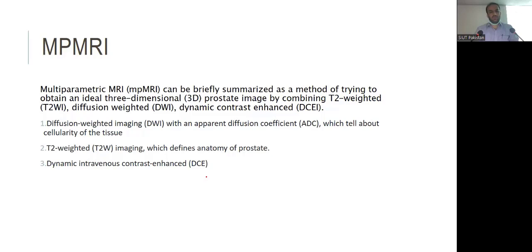On this basic rule we apply it to prostatic cancer and easily pick up the lesion, even small lesions less than 1.5 centimeters, which are easily missed on normal T2 weighted images. So diffusion weighted technology is easily applicable and greatly increases the yield of prostate cancer detection.